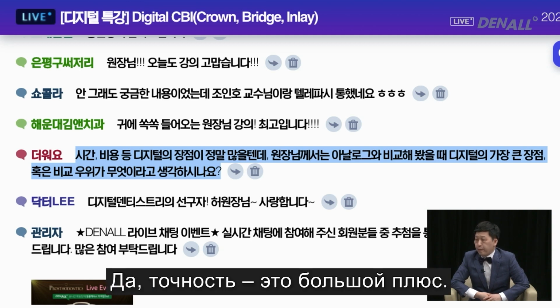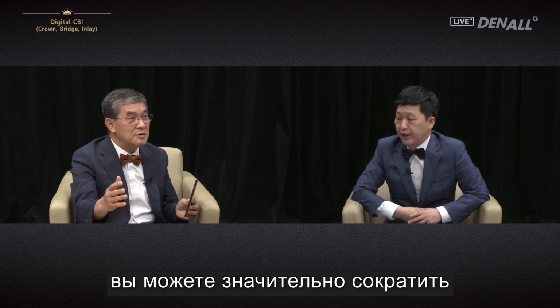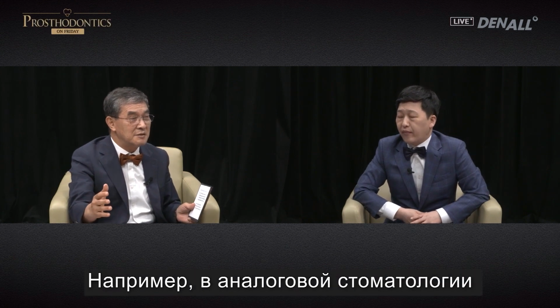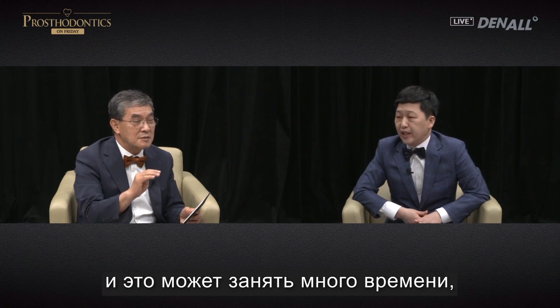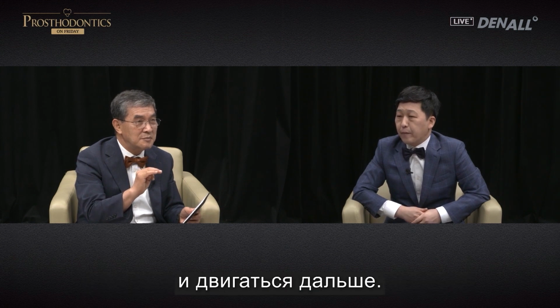Yes, accuracy is a huge plus. I think compared with analog, you can reduce time and effort significantly. For example, in the analog dentistry, you need to wait until the stone solidifies, and it can take a lot of time. But with digital dentistry, you can just do scanning and move right on.